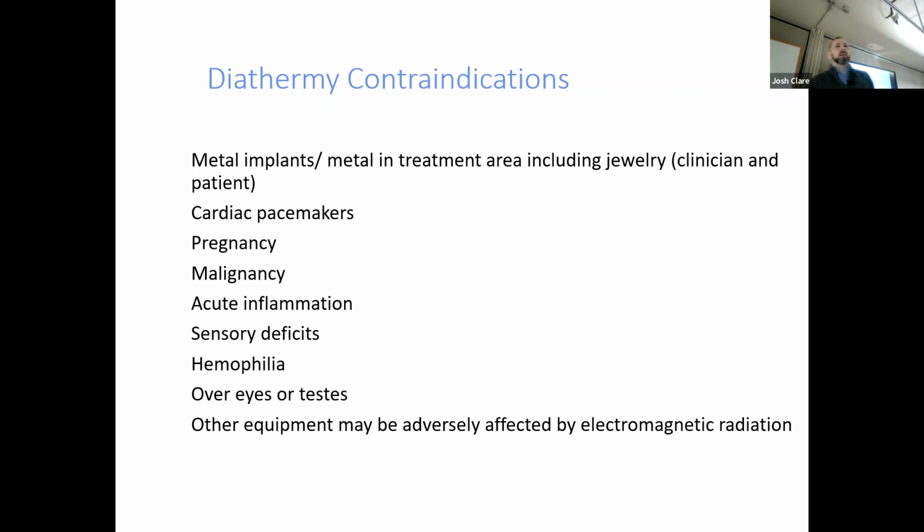All right, in the skilled nursing facility, again, most of this in real life, diathermies are used in skilled nursing facilities and not really anywhere else. So how many of our patients who have to spend some time in the rehab facility have pacemakers? It's more than the general public. If you want to find a pacemaker, I would say SNFs and casinos. Those are the two places I'm going to go look.